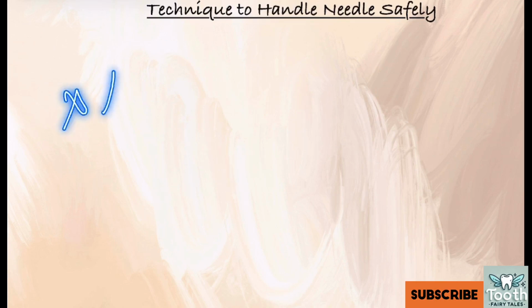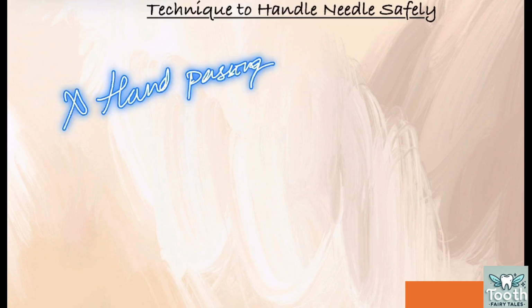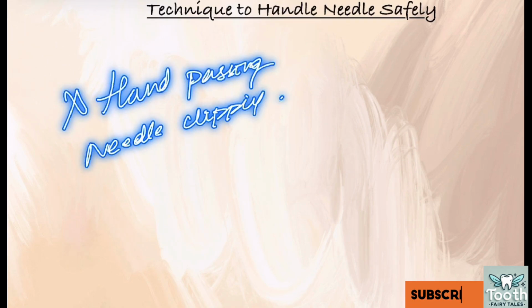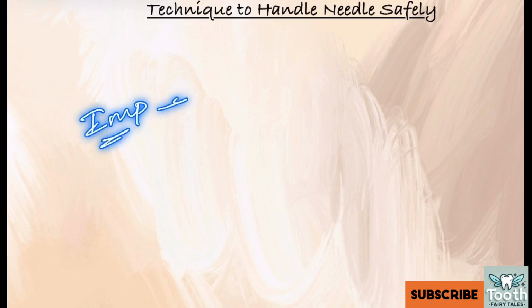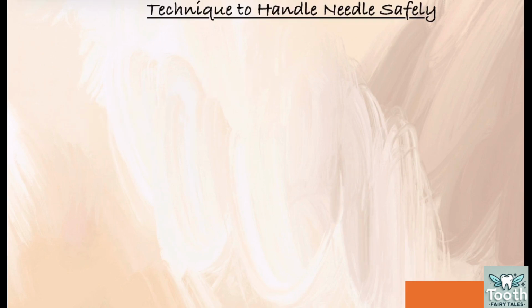Avoid hand-to-hand passing of the needle. There are also some needle clipping devices. And immediately dispose of the needle into the sharps container. By this, we have completed our discussion on the dental needles.